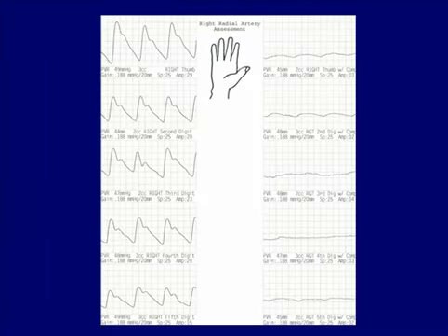One way to test for that is with physiologic testing. Again, here's an example where it's probably better to use physiologic testing than arterial ultrasound imaging. Here we have PVR waveforms of the digits of the right hand, and then we've manually compressed the radial artery, and we repeat these, and we can see that these are textbook normal.